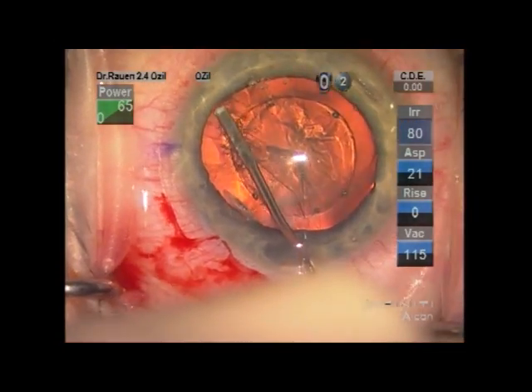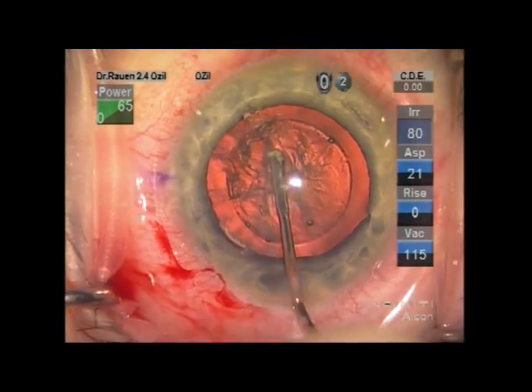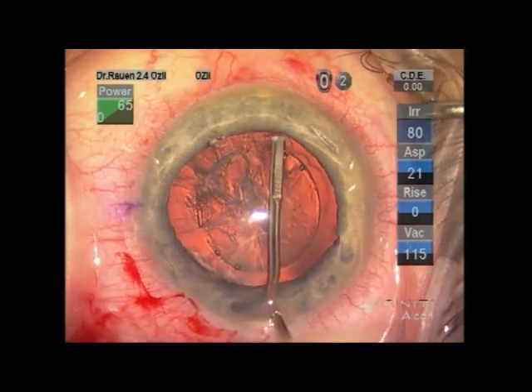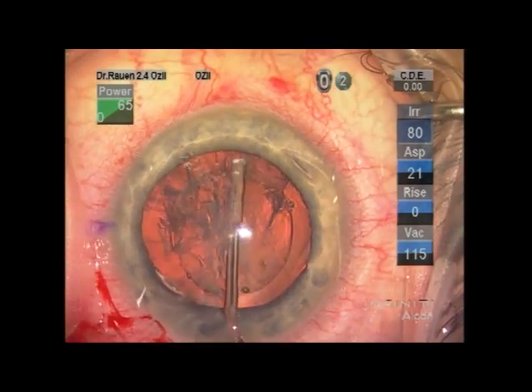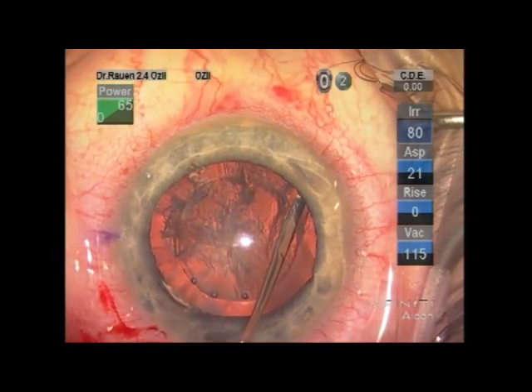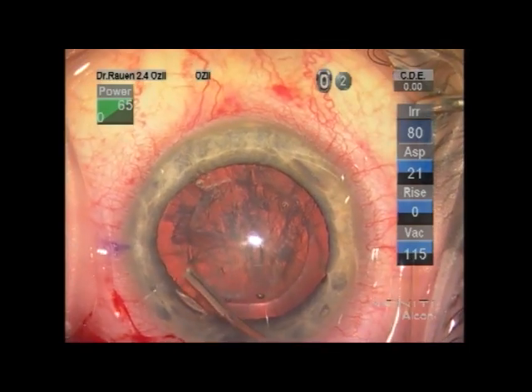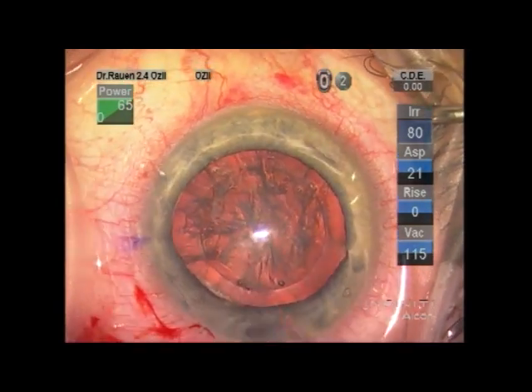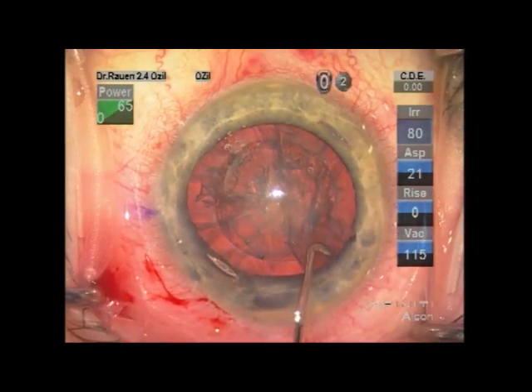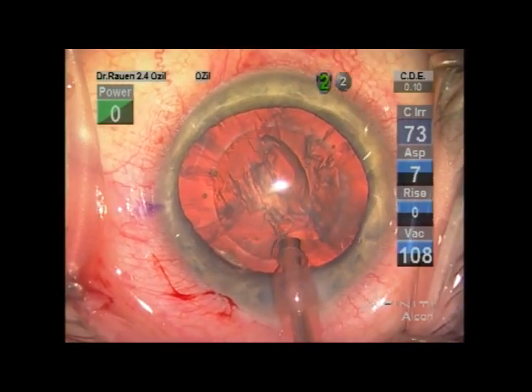We're now separating the lens from its capsular attachments, and we do this with gentle fluid waves. Some users of the LenSx technology have described some differences in cortical aspiration. So in this case we're being extra careful to make sure we have roughened up the peripheral cortex. We're even using a Chang cannula here subincisionally to add more BSS than we would typically use.